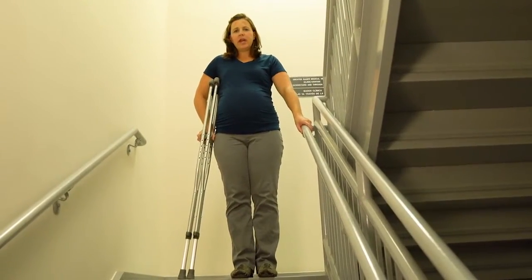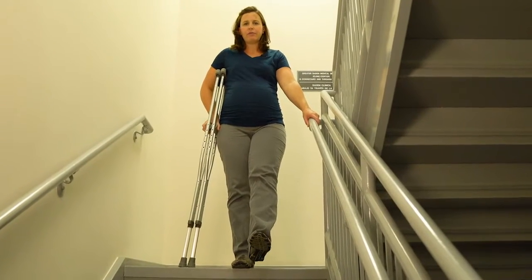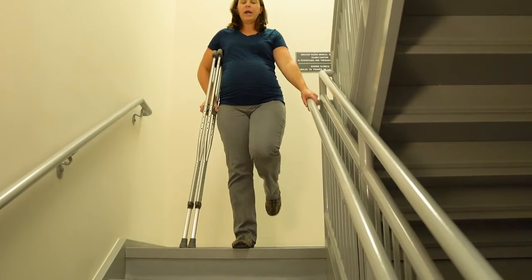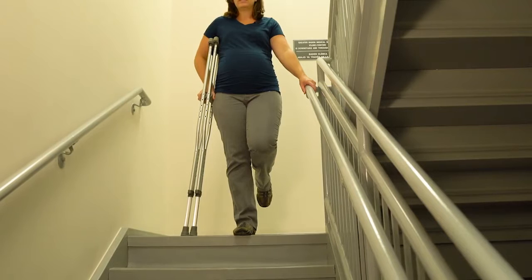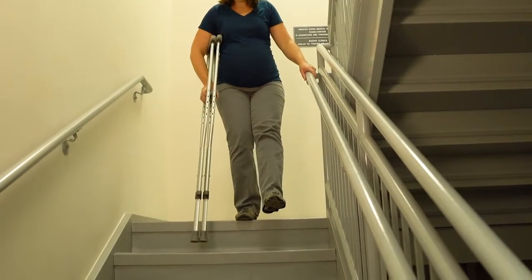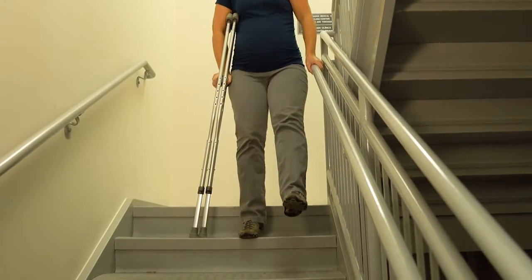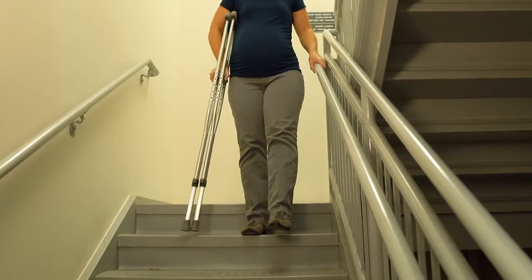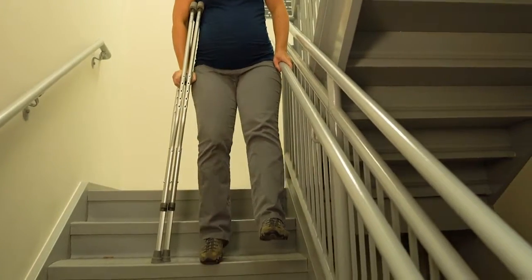If you can't put any weight through the leg, when you're going down the stairs, you want to be sure to put the leg out in front of you. If you put it behind you as you're going down the stairs, there's a good chance that your foot might hit on the step behind you. So place the leg out in front of you, put the crutches down, use the railing to help steady yourself, push through the arms, and just take a nice light step. Again, you can have family members assist you.